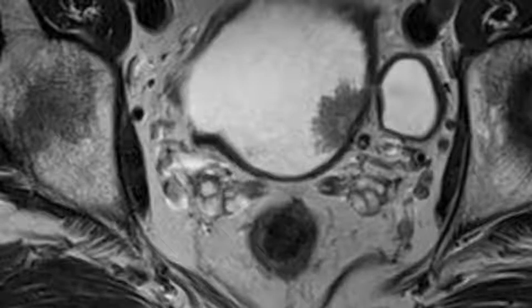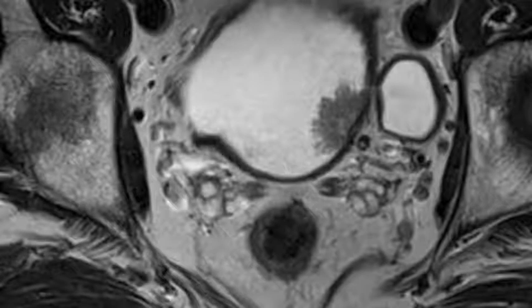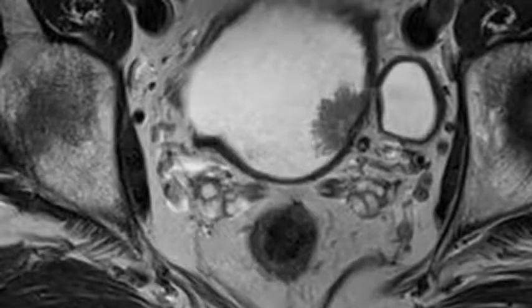Diffusion-weighted imaging provides both qualitative and quantitative information that reflects changes at the cellular level concerning tumor cellularity and cell membrane integrity. For most bladder tumors, increased cellular density manifests as increased signal intensity on diffusion-weighted images, with reduced apparent diffusion coefficient at quantitative analysis. At some institutions, diffusion-weighted imaging is currently being used primarily for local staging.